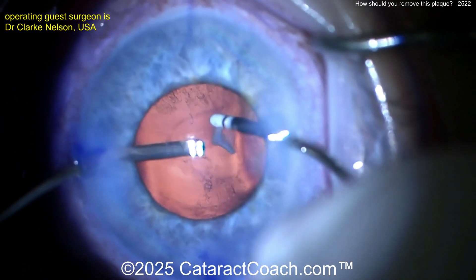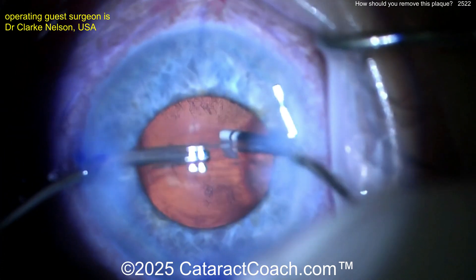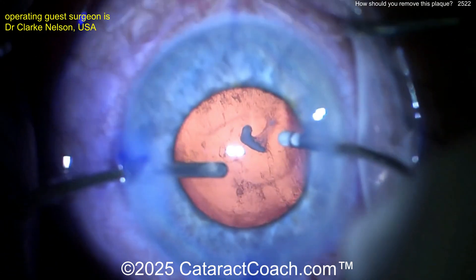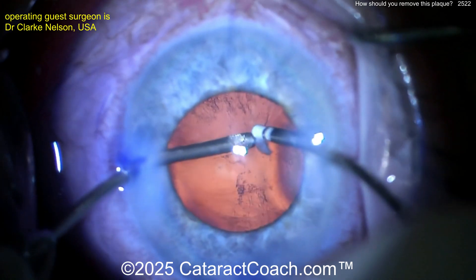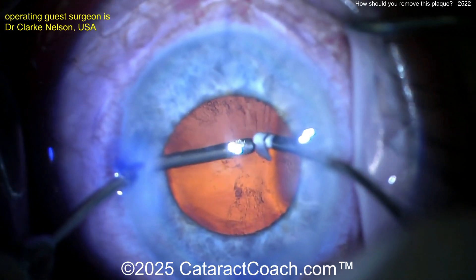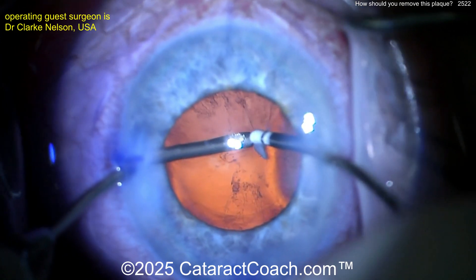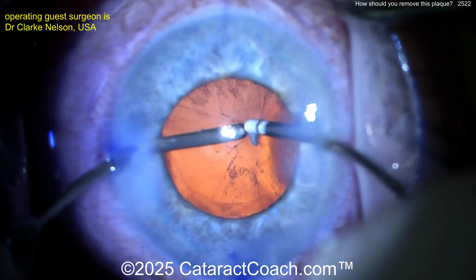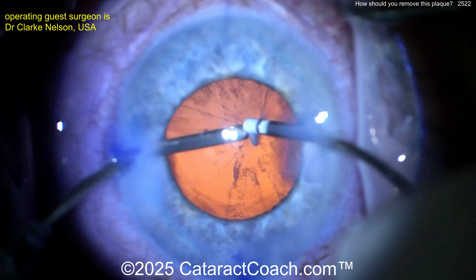And now going back to our case here, I'm trying to get that plaque off — sometimes you can get it off, sometimes you cannot. But keep in mind how thin is the posterior capsule? At its thinnest point, the posterior capsule is four microns. One red blood cell diameter is seven and a half microns. You're talking about half of a red cell — the red cell radius. That's nothing. A strand of hair is probably 80 microns, so a twentieth the thickness of a strand of hair. Yikes, that's very little.